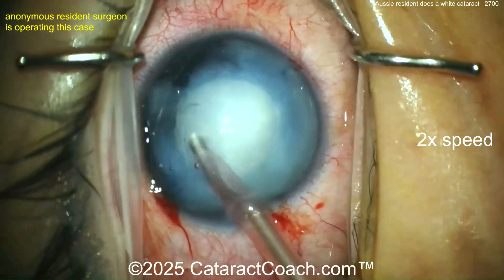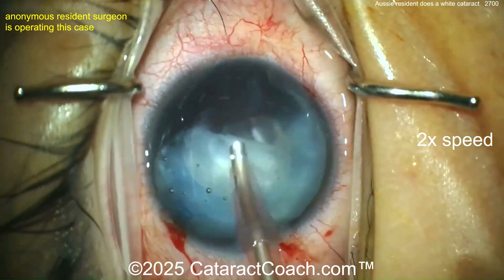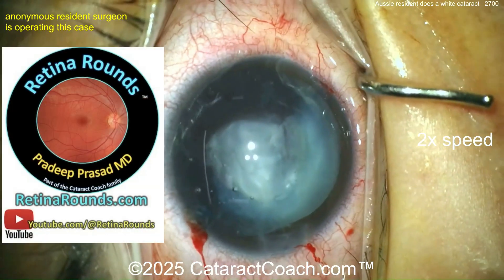Look at this — aspirating out just that lens material. This is a butter-soft lens. There's no need to chop a thing. Comes out nice and easy. Wow, easy breezy. The rest of the eye done.